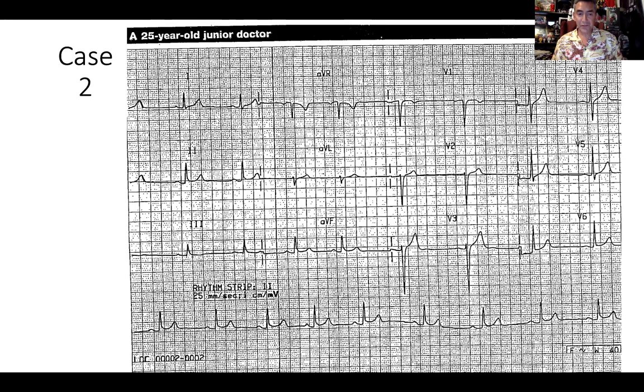Case two. Again, we have our lead one, our lead two, our lead three, and then our rhythm strip.